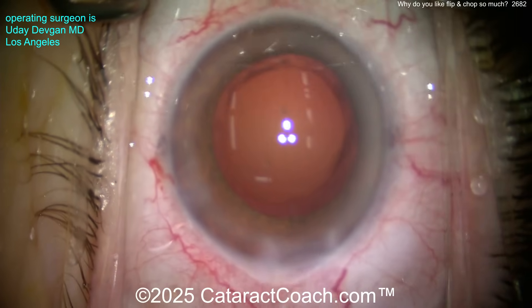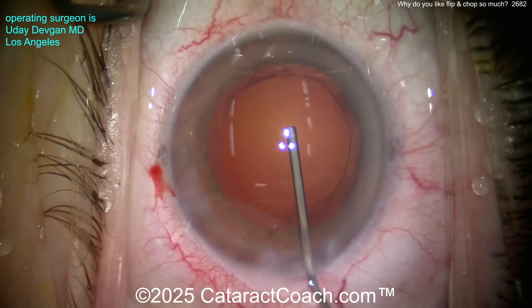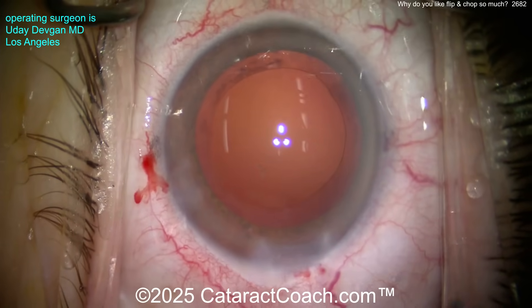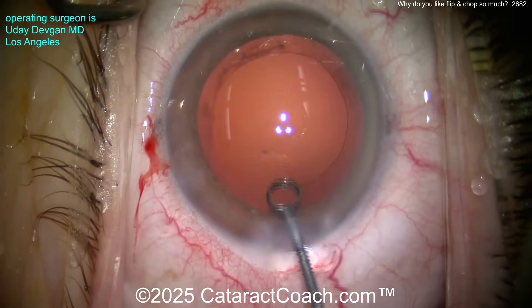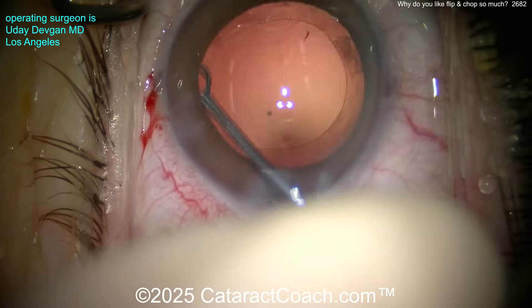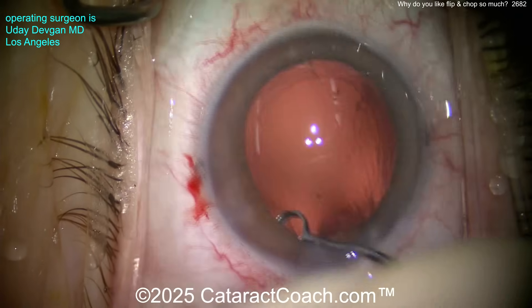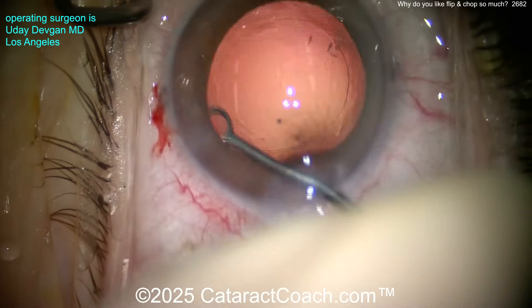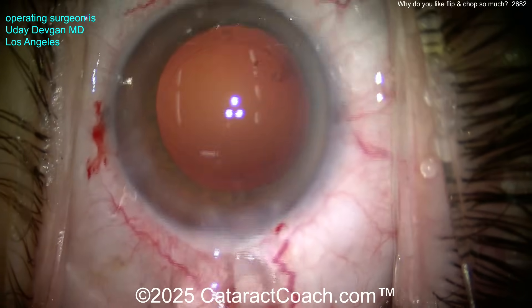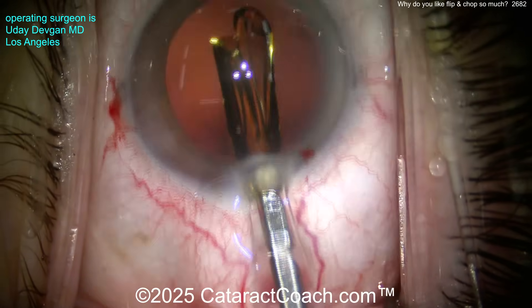Now you have a nice, clean, empty capsular bag. We'll fill it with our cohesive viscoelastic and polish up that capsule a little bit too. You may be thinking the rhexis looks too big, but I'm going to show you it's not — remember, this is a hyperopic eye, so it's not a very large white-to-white. Here's the capsule polisher — just clean off some of those lens epithelial cells. Even if it doesn't prevent PCO, it reduces the inflammatory load from lens cells and lens proteins. Here comes our single-piece acrylic toric monofocal lens going into the capsular bag.